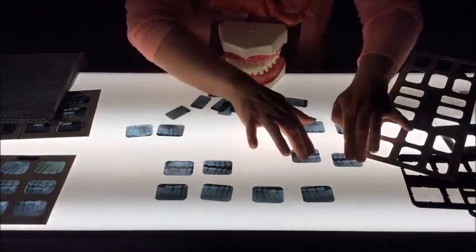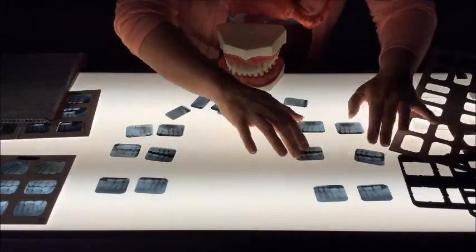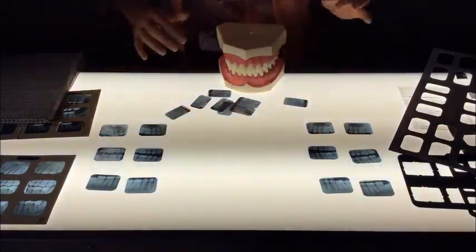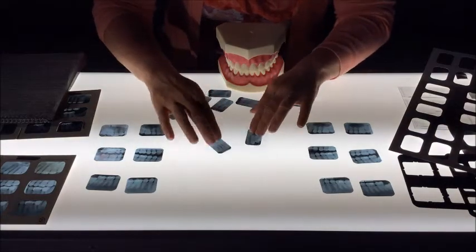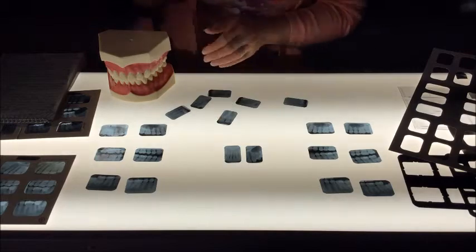The last types of films that we would want to orientate would be our anterior periapicals. Again, anterior being the front view, periapical being around a root of a tooth. So again, we'd want to look for films that show the crown and the whole root of the tooth.